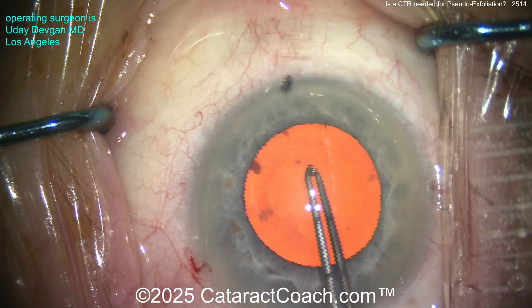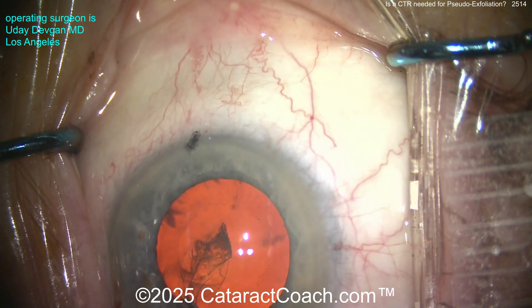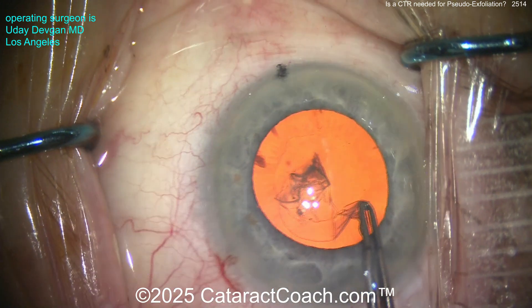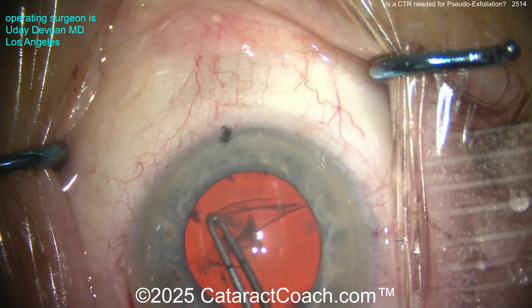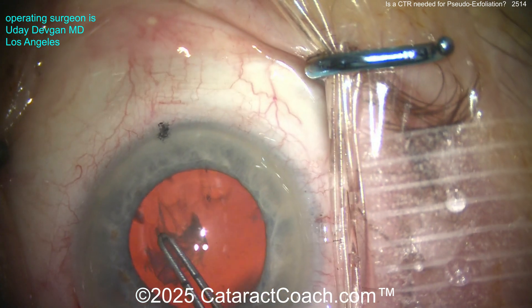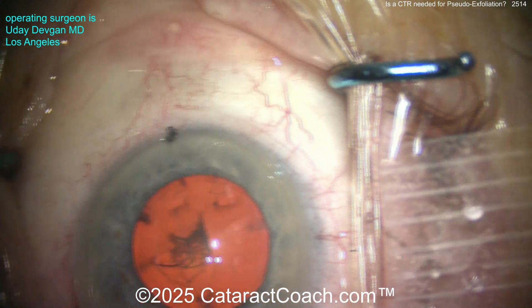This is a very important step — watch as we poke in: how much wrinkling is there in the capsule? Not too much, actually. If very loose zonular support is present, it's really hard to poke in with these forceps, which are not that sharp. But if the capsule is taut enough to poke in with the forceps, it gives a good idea about zonular integrity — which seems okay here. My forceps are marked at 2.5 and 5 millimeters. I stop periodically to check we're getting the correct size rhexis — I want about a 5 to 5.5 millimeter rhexis. That looks just about perfect.